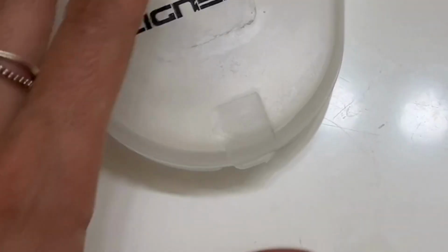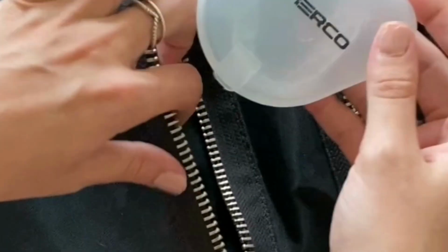When it's time to eat, simply remove your clear aligners to avoid any discomfort or potential damage. Store them safely in their case to keep them clean and protected. Remember to maintain good oral hygiene. Before reinserting your aligners, make sure to brush and floss your teeth thoroughly.